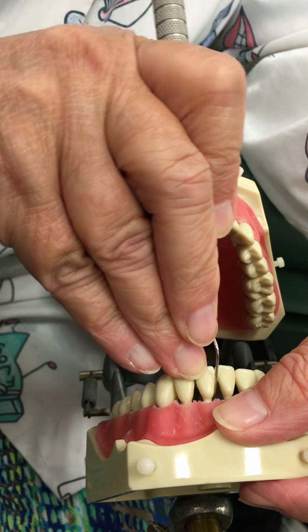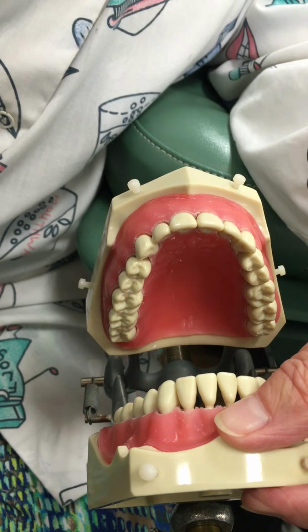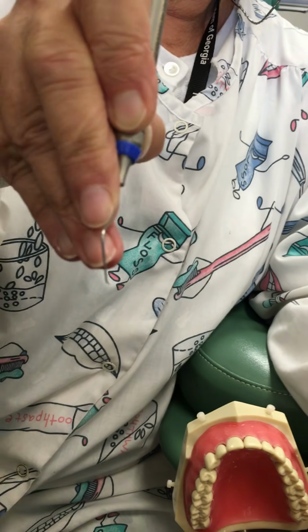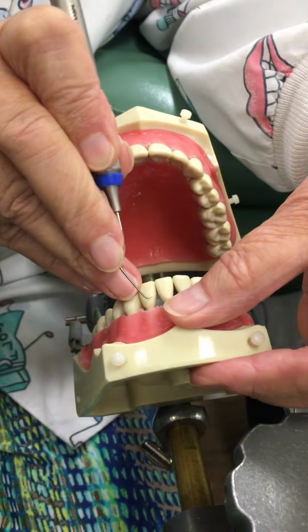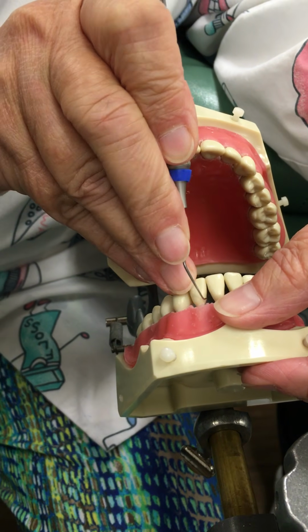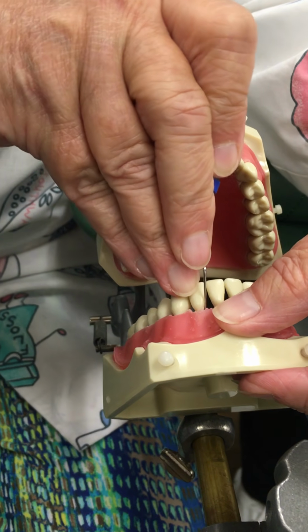So every stroke, I am rolling that toe toward the tooth. Now, notice where my second finger is on my fulcrum finger. Do you see that? The shank. It's sitting on top of my fulcrum finger, so I'm piggybacking my fulcrum finger. My second finger is on the shank where it should be, but now my second finger is also piggybacking my fulcrum.